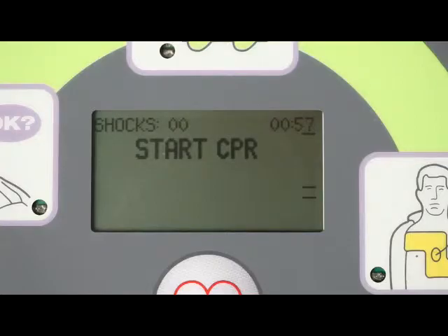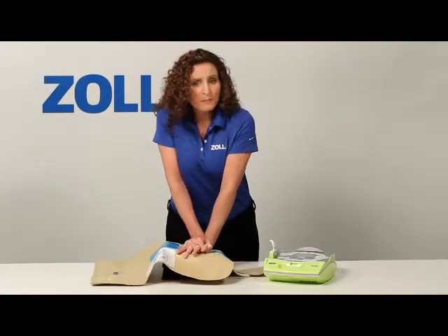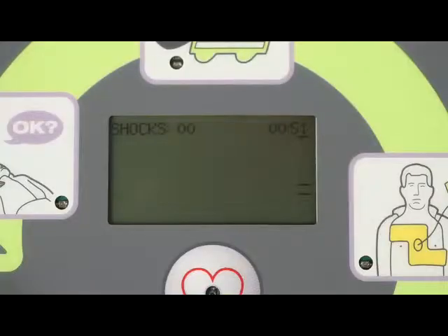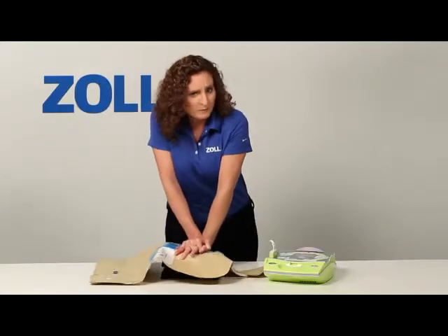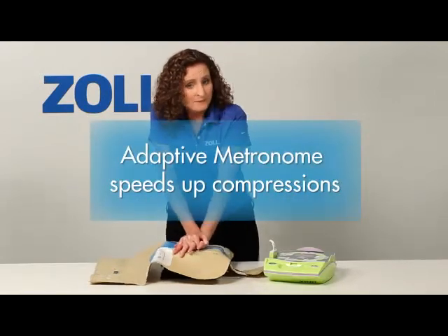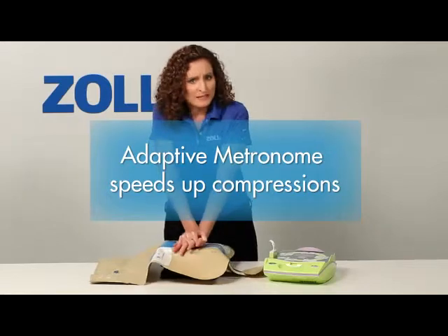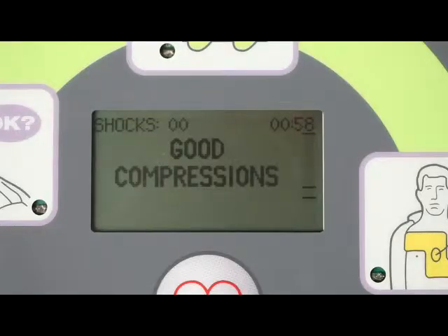Start CPR. Notice the bar gauge on the display as I start chest compressions. Push harder — I am not pushing hard enough. The beeps act as an adaptive metronome that monitors my compressions and tries to speed them up to at least 100 per minute. Good compression.